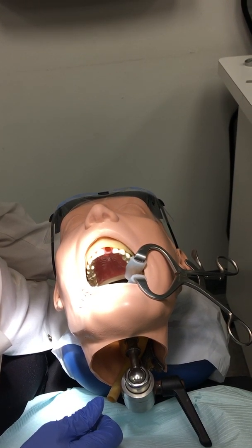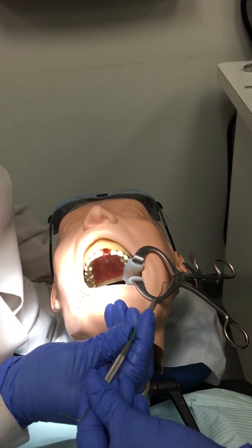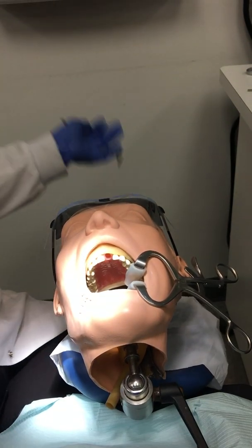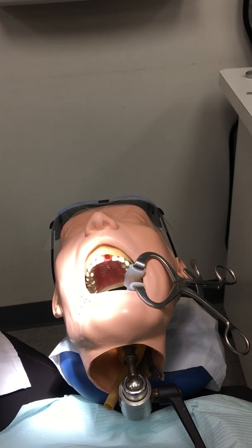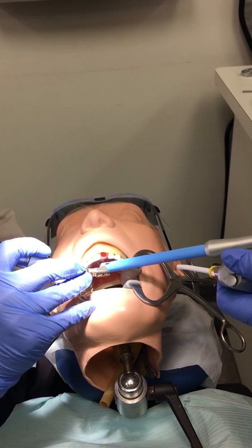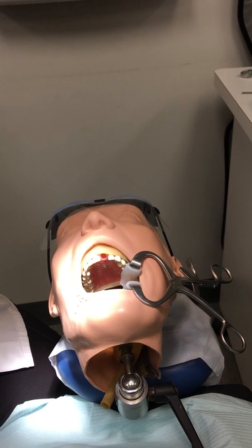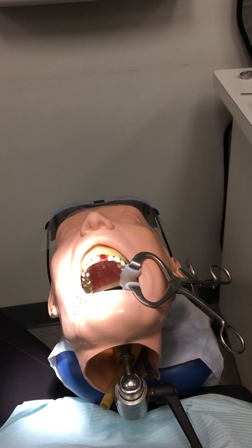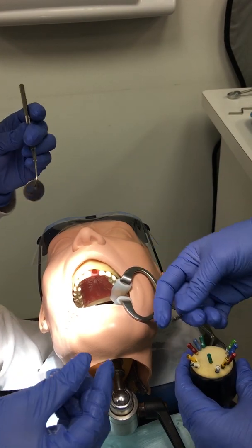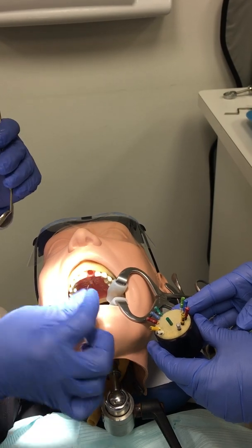Pass the endo explorer. The doctor will use the explorer to access the canals. Gates glidden drills may be used to help open the canals. Have the files ready, then pass the doctor the appropriate brooch. This is used to remove the necrotic pulp tissue from the canal. These are normally identified by color.